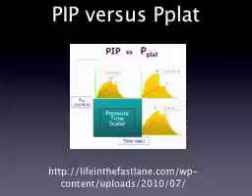When they don't correlate, well, there are actually two criteria. When you see the peak inspiratory pressure elevated, if it's above 30 to 35, you need to find out why it's elevated. And PIP can be elevated for one of two reasons. High airway resistance, and this would be things like my endotracheal tube's too small, my tubing's kinked, I have a mucus plug, bronchospasm, and secretions in the tube, and so on and so forth. If this is the case, the PIP will be elevated, but when I do the plateau pressure, it's going to be much lower than the PIP. So there will be a very big difference between the PIP and the P-plat. And that difference, that delta P, is actually indicative of airway resistance. There's a lot of resistance there.